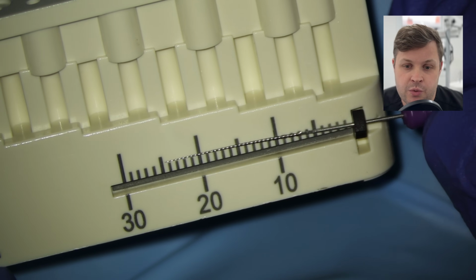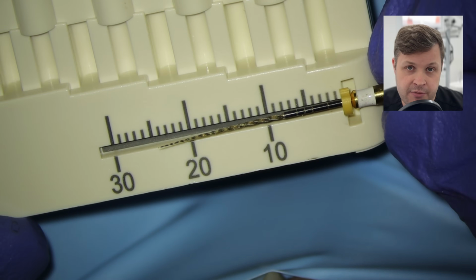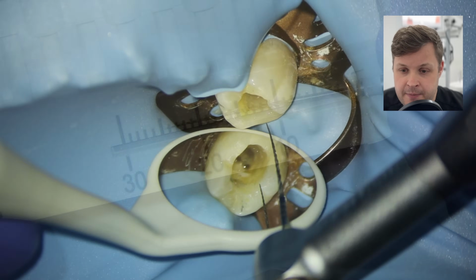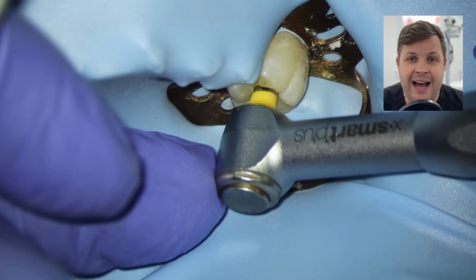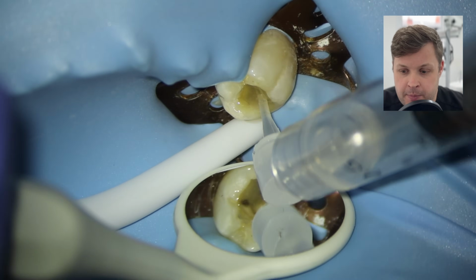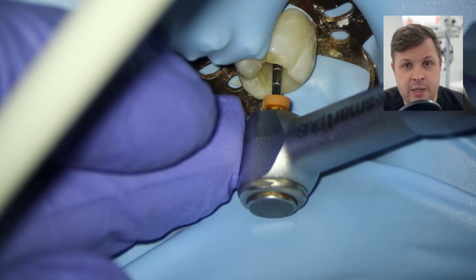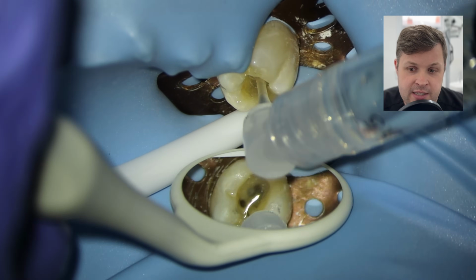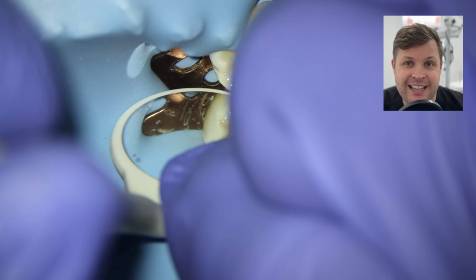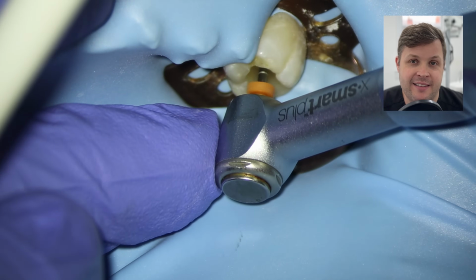Okay, we're going to use our glide path file at the 0 reading, that's 24.5 millimeters, and we're going to just shape that mesiobuccal canal. And then we're going to use our HyFlex 25 variable taper here, and you'll notice that I have to take a few sweeps at this because it's quite difficult. This HyFlex file isn't quite reaching the working length as quick as we'd like it to.